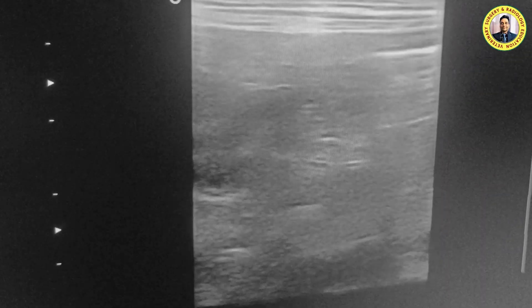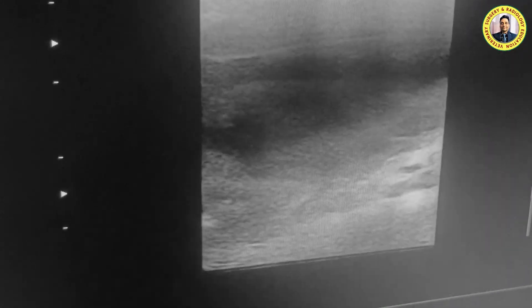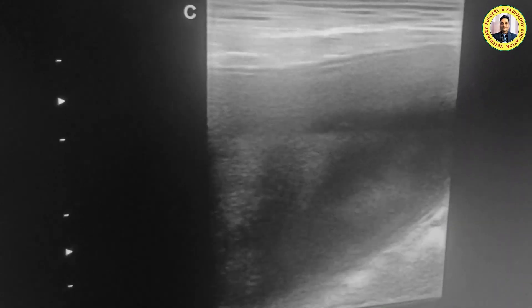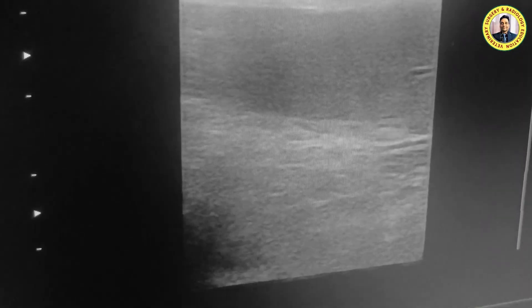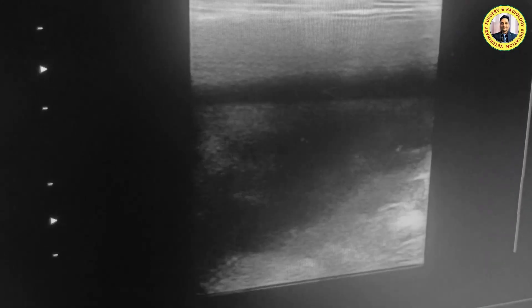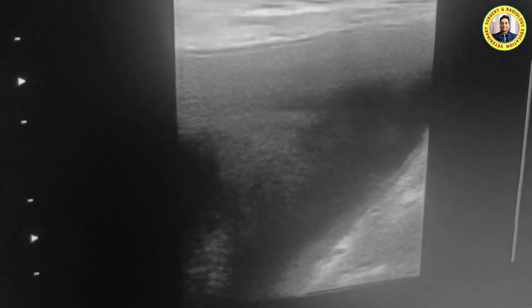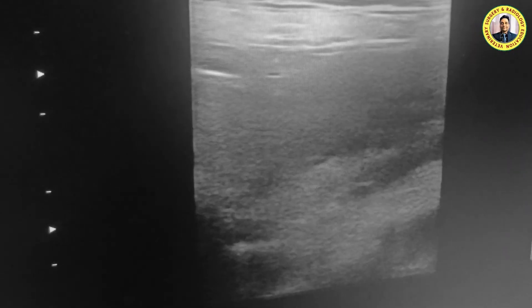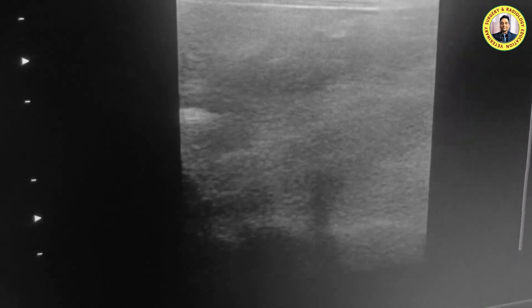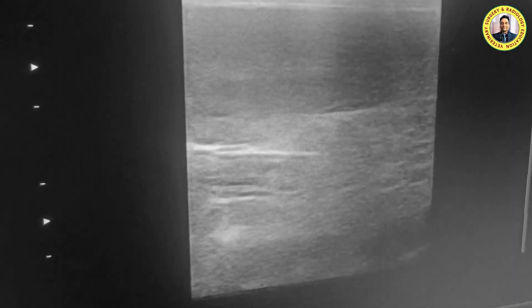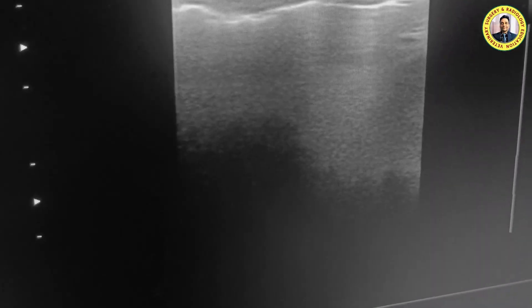If you go down to the urinary bladder, you can see it is filled with urine. In the urinary bladder, we look for sediment or any abnormalities — there is no such abnormal image formation. Moreover, as per history, there is no problem with urination either.